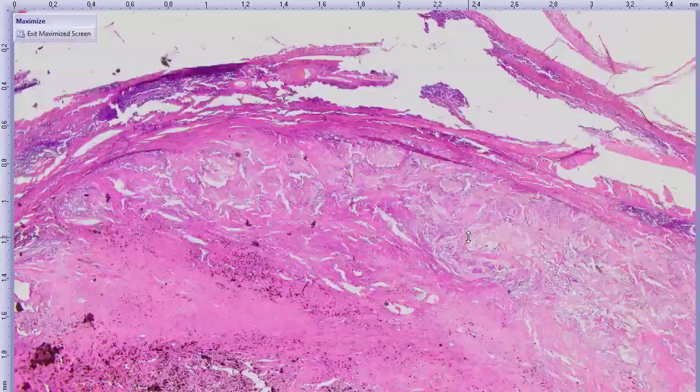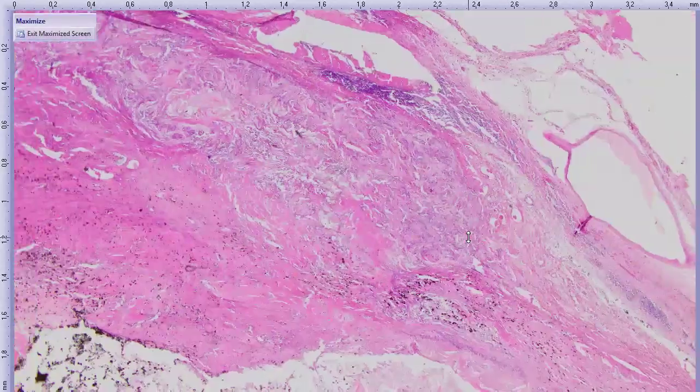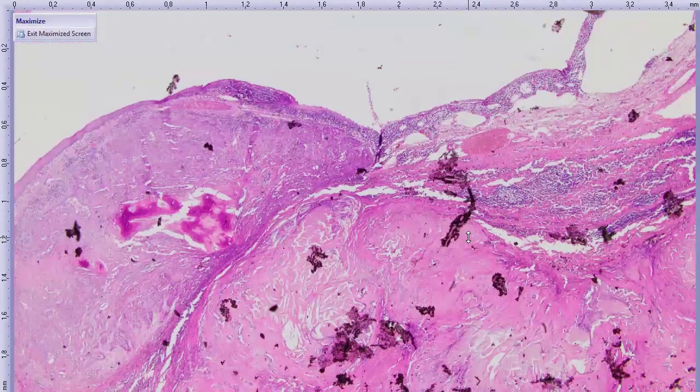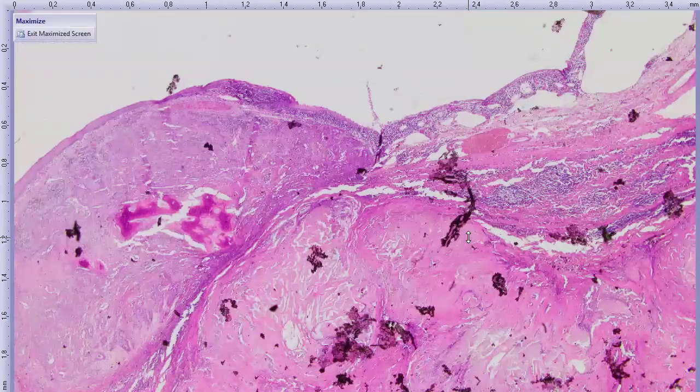What we have to deal with here is the whole thing, like what is going on with this eye? Because this tumor is everywhere, it's infiltrating the sclera, causing a scleral rupture, right? We know there's a history of very chronic disease. They said the first time they saw this was more than a year ago. So we don't know how long before that.